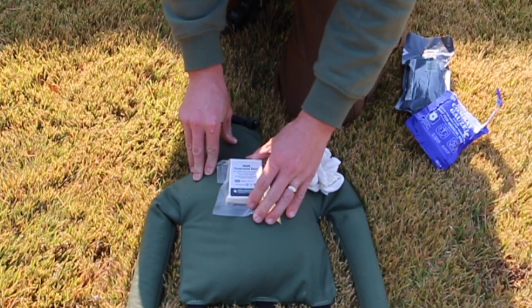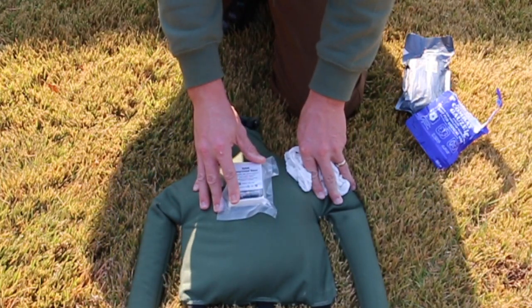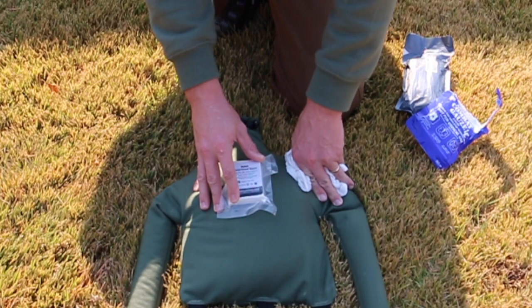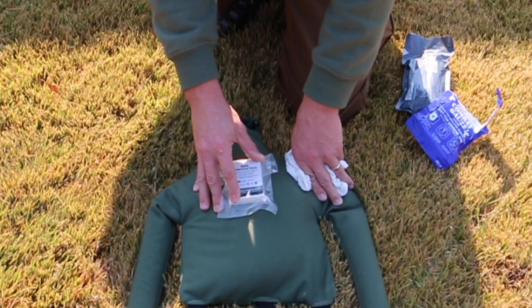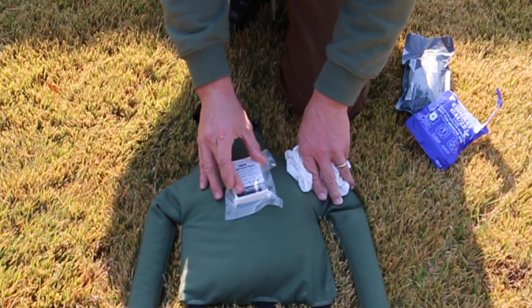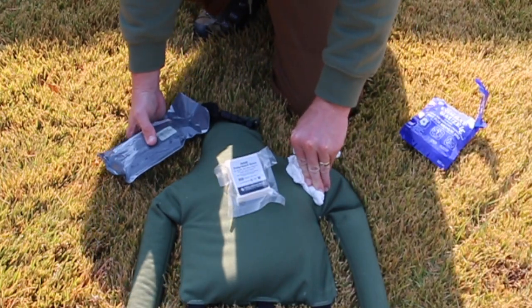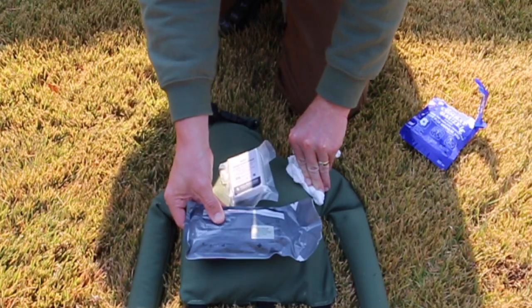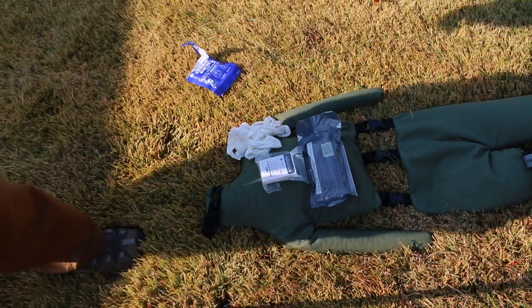Now, if all you have is the compressed gauze, absolutely, you can use that just like we use the combat gauze here. So if you're using a non-hemostatic agent gauze, you really need to hold it for 5 minutes. If you're using hemostatic agent, the 3-minute mark should be good. But if non-hemostatic agent, you're gonna be 5 minutes there. So now we've got all this gauze packed here and we need to keep it in place. So that's where we would use our Israeli bandage, is to hold this in place.